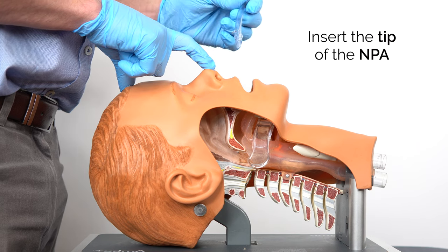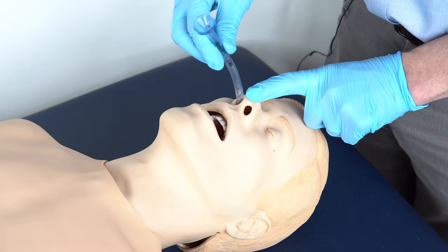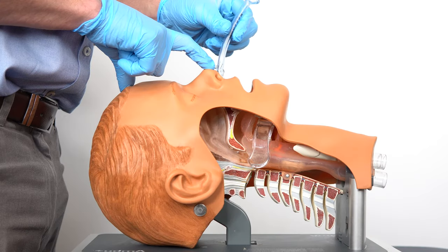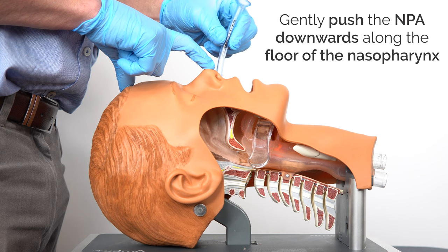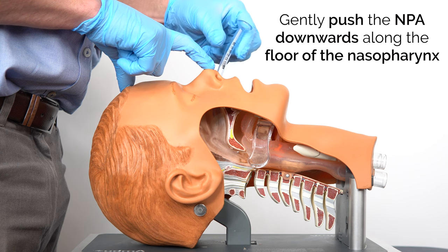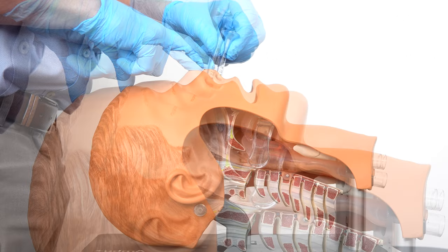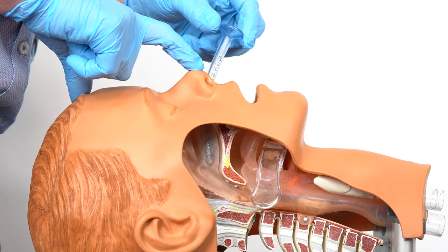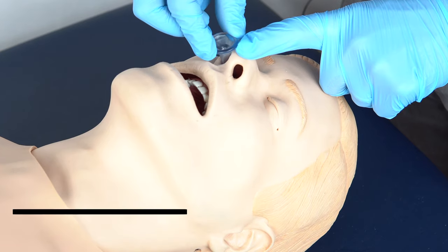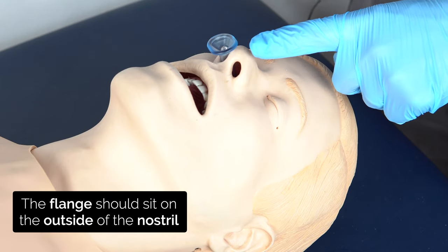Then we're going to gently insert the tip into the nostril, heading downwards and gently twizzling the tube, letting it gently seat itself in. I'm going to keep pushing and gently twizzling until the flange sits comfortably on the outside of the nostril.